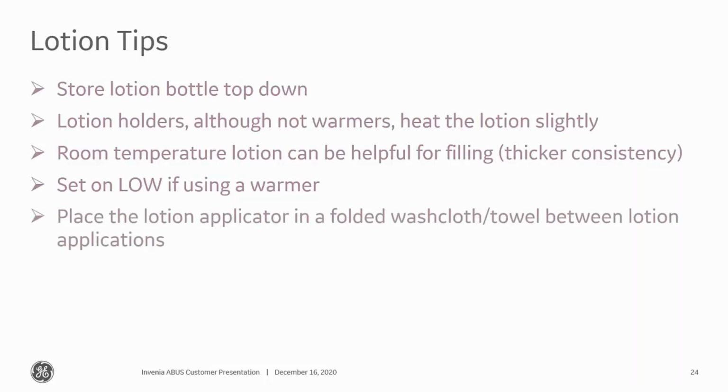Another good tip is to maintain a spot where you always have that lotion applicator, whether it's during the scan or after the scan. A good pro tip is to use a small washcloth and fold that lotion applicator in the washcloth as you're using it to scan the patient. That way you know where the lotion is. It also keeps me from sticking my elbow in it, or the patient possibly placing their hand or arm in it as well.